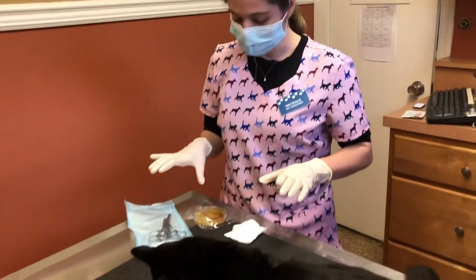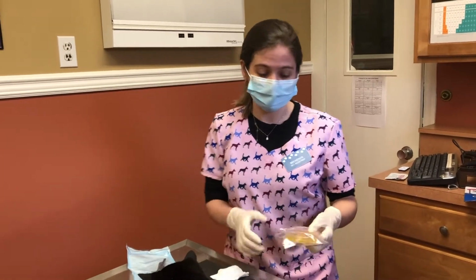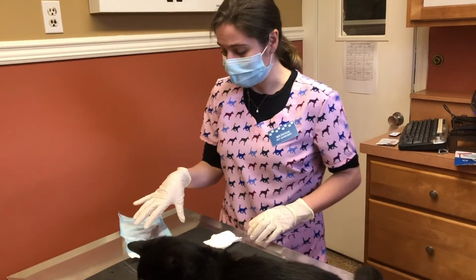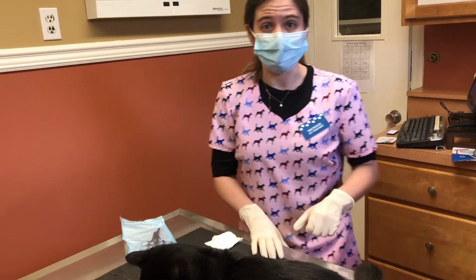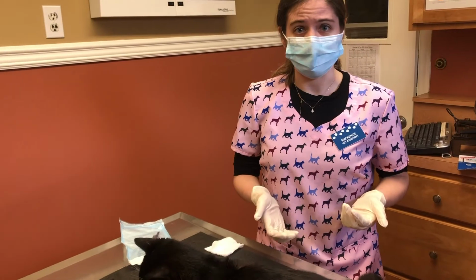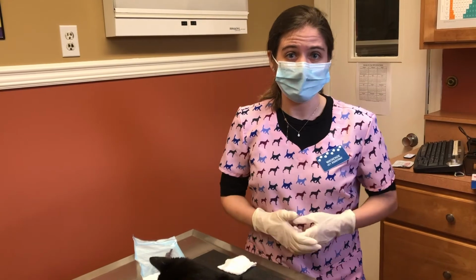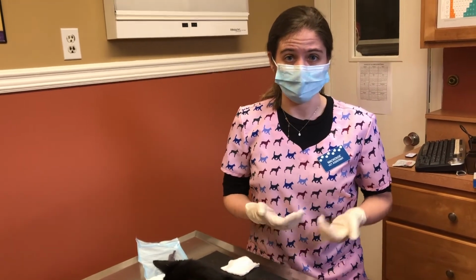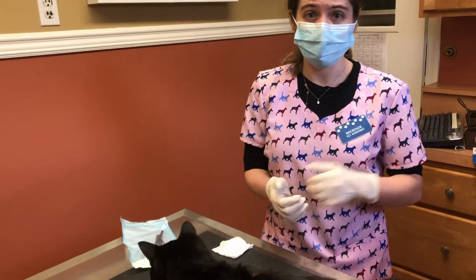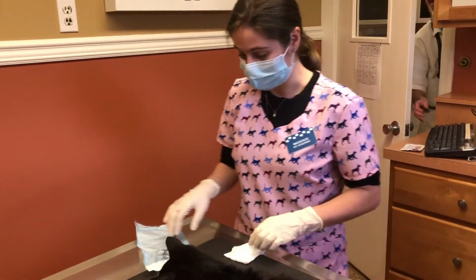So what I'm going to be using to collect my sample is I have my medium. This is a dermatophyte test medium, or a DTM, and I have my sterile hemostats that I'm going to be using to pluck the fur from my active lesion. There are other ways that you can collect samples. You can use a toothbrush to brush the scaly skin. You can use a swab applicator to do something similar. In this case, we're going to be using our hemostats. And I have my gloves so that I'm not coming in direct contact with a potentially hazardous organism.